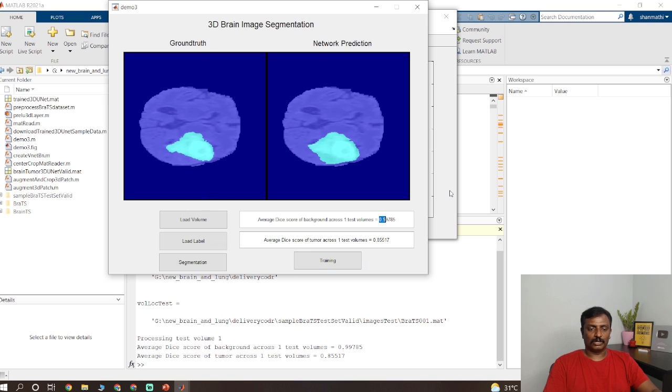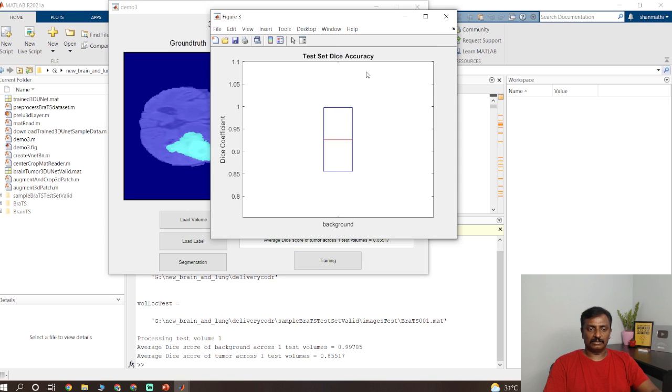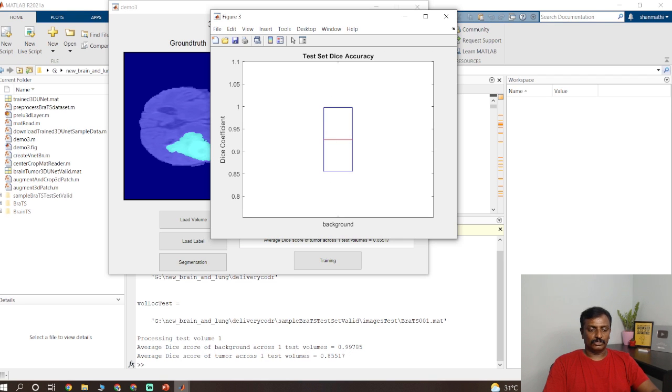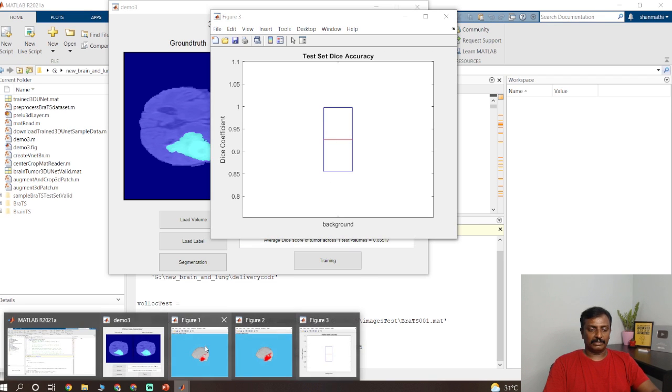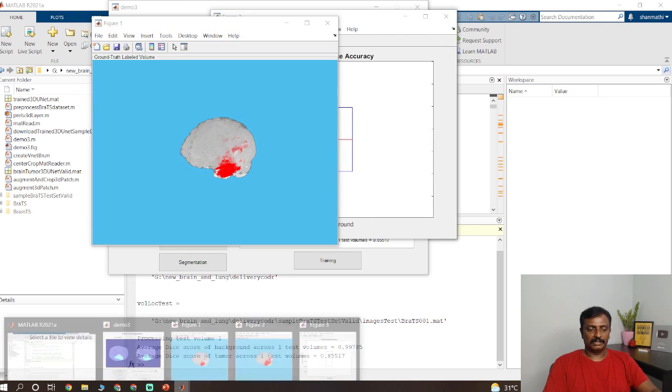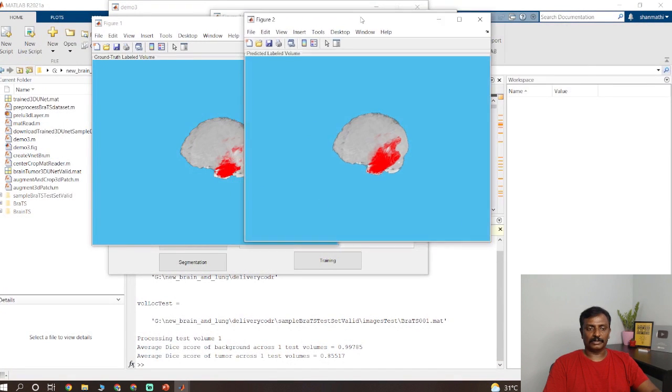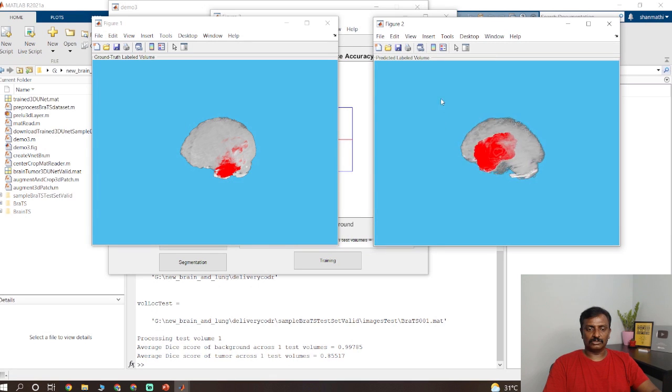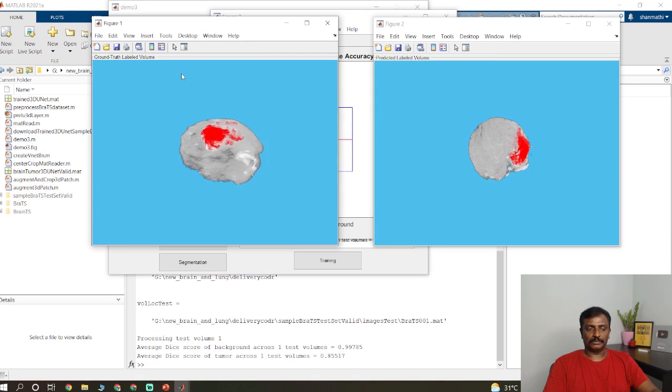So if you check out this, this is a DICE graph, DICE accuracy. And you could compare, this is the ground truth label volume and this is the network predicted label volume. So you could drag and drop and you can check it out.